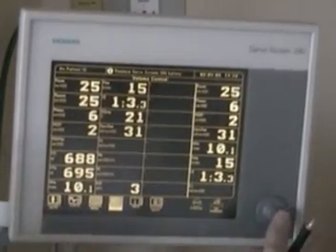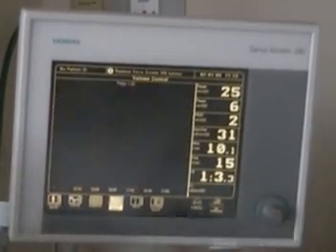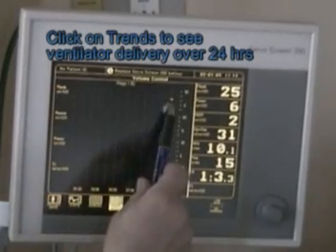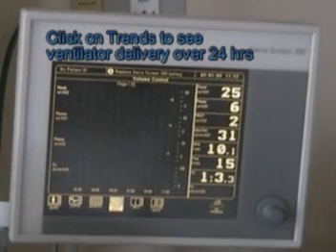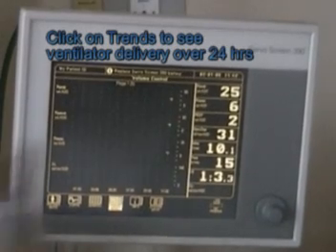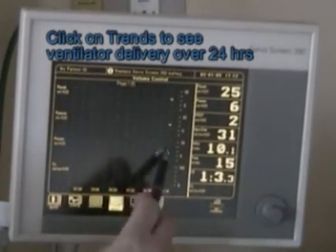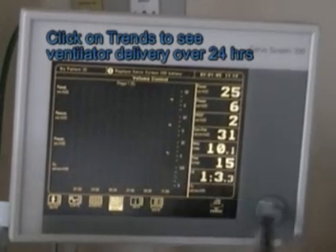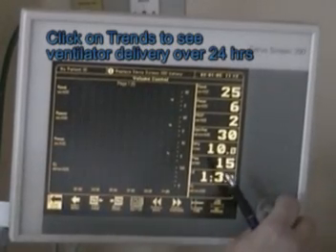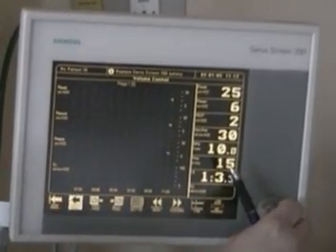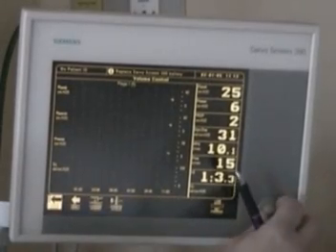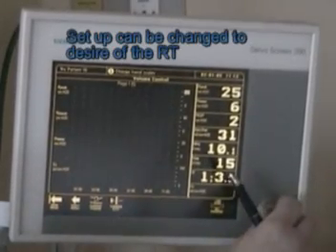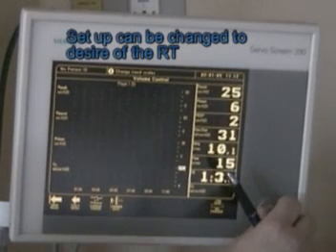Trends will give that to us and will display the length of time this ventilator has been on. Since it hasn't been on very long, we don't get much trend information. If we wanted to change the setup so we can see a little bit more, let's change the scale and go down here.